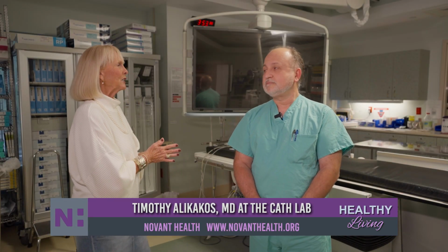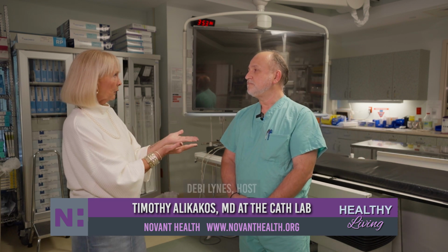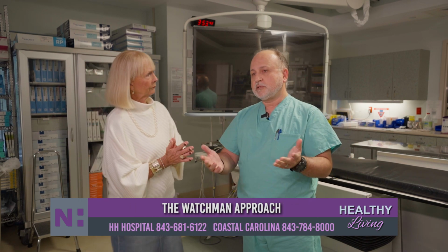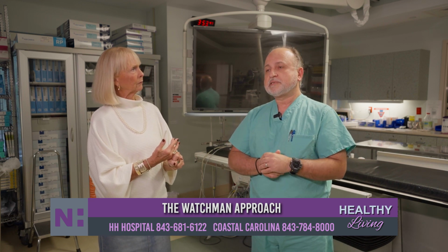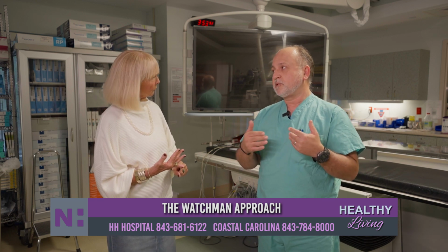Again, Dr. A has joined us, and we're going to be talking specifically now about some of the techniques that you do. One in particular that you wanted to share with us today. So we wanted to talk about the Watchman procedure. It's otherwise known as a left atrial appendage occlusion procedure. It's used predominantly in patients that have atrial fibrillation, a rhythm disorder in the heart.